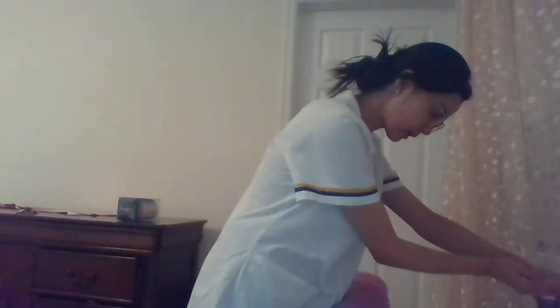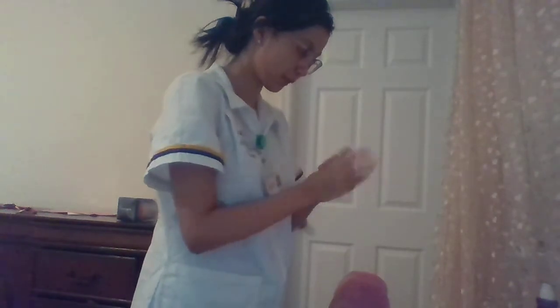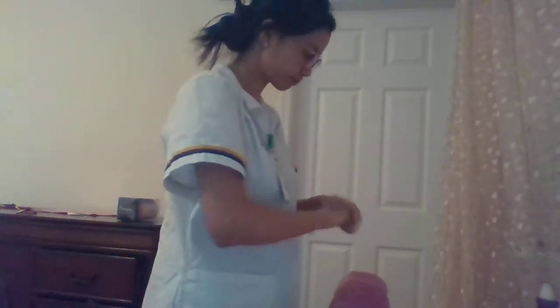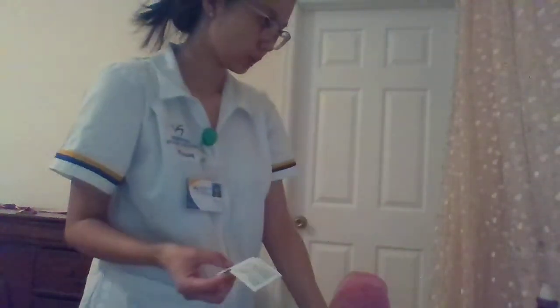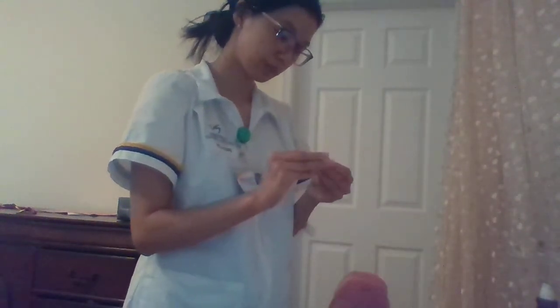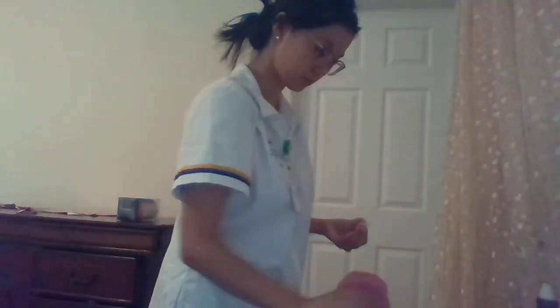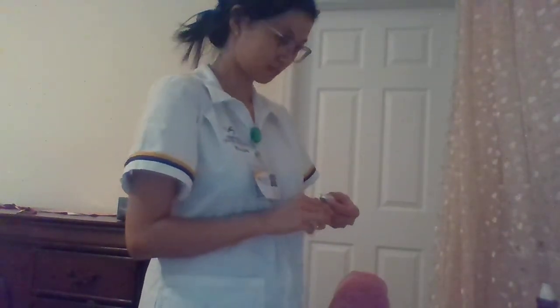I am going to wash my hands again in order to prepare the medication. First of all, I'm going to clean the rubber stopper with my alcohol pad really hard for 30 seconds.